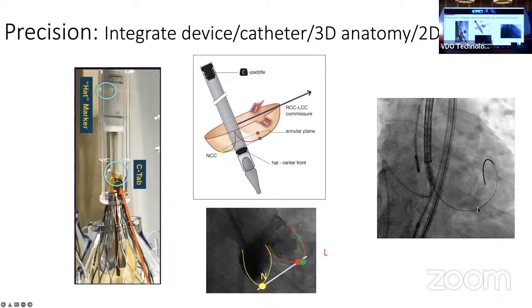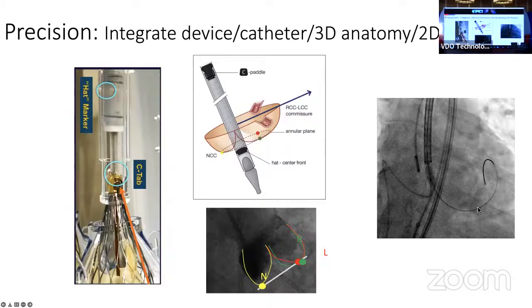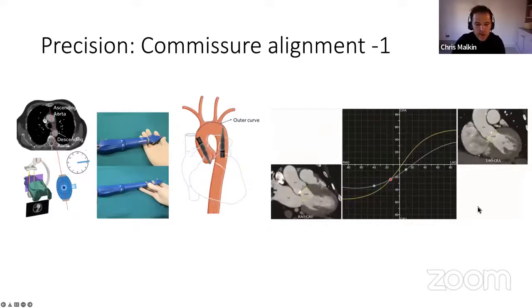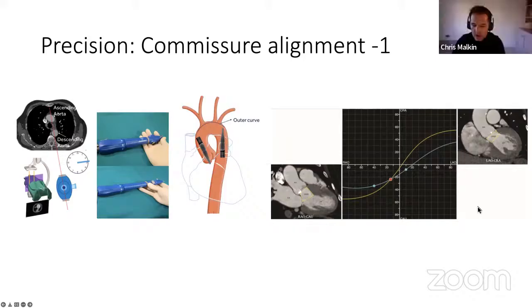And that involves working in this so-called cusp overlap view, where the left and right commissures are overlapped. And that means on the right side of the screen is the left-right commissure of the patient. And on the right side of the screen will be the commissure of the TAVI valve. And there are some very simple maneuvers that you need to know, which is, for this product anyway, you introduce the valve system into the body with the flush port at 3 o'clock. And you have to work in this so-called cusp overlap view that you see on the right side, where the LVOT is seen one-to-one fluoroscopically rather than foreshortened.